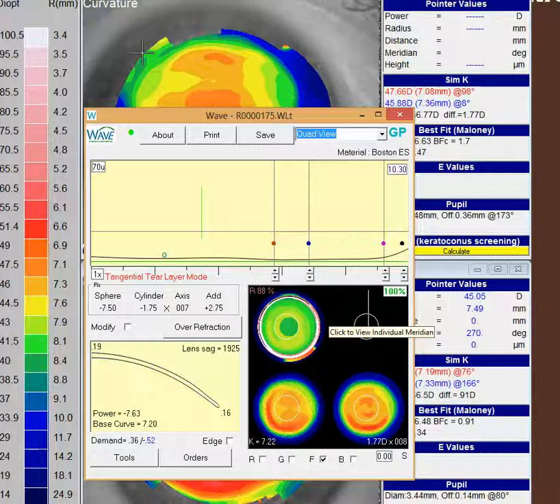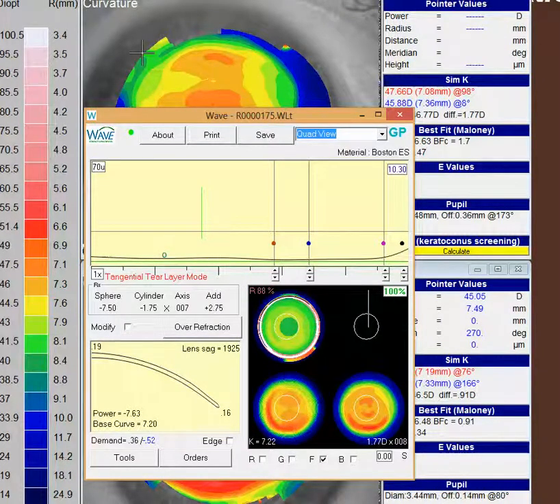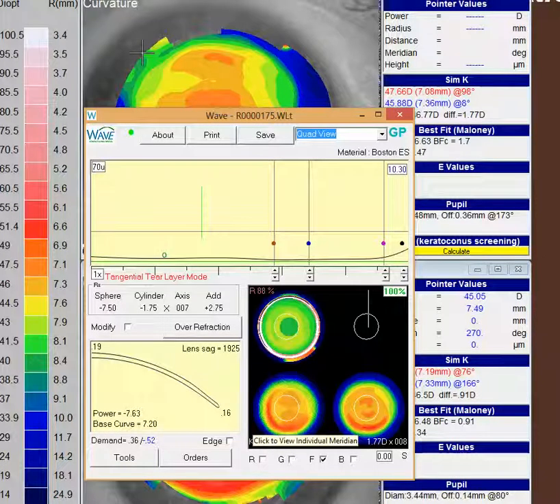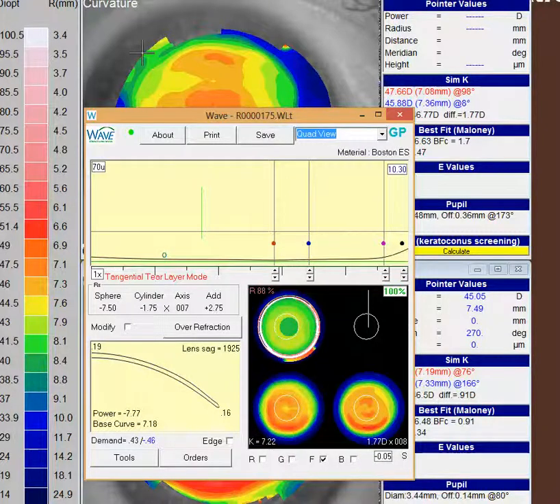The other thing you can do is sometimes if you put a little more asphericity out here in the peripheral part, you'll notice what happens with this base curve here. If you look at the back surface of this contact lens compared to the front surface of the topography, if we flip over here, just put a little bit in there, notice that all of a sudden it looks very similar.